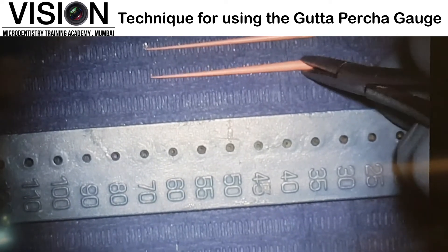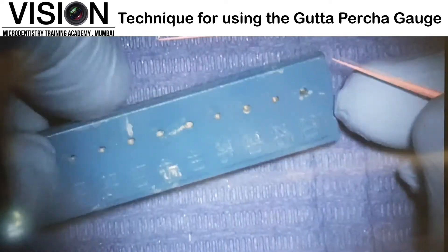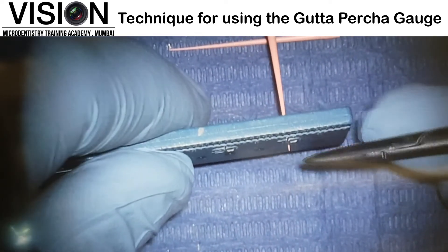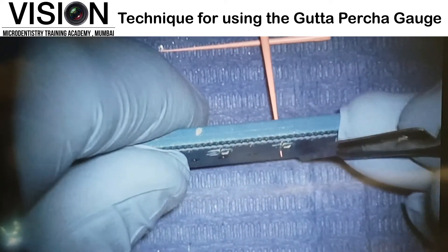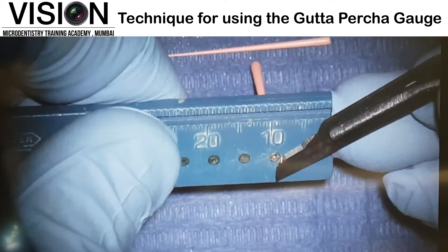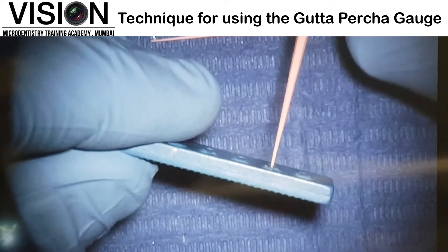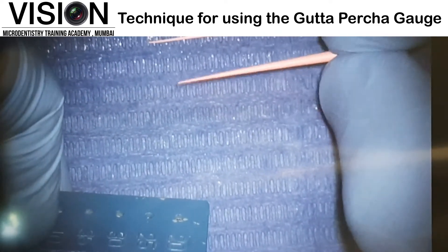Now when we need to customize these points, what I will do is place them in, for instance, the number 25 hole and check on the other side. Whatever excess Gutta Percha comes out will be cut by a sharp blade. We have to make sure that this GP point is now flushed with the hole on the opposite side. Once this is done, we now have a Gutta Percha point which is customized to size 25.